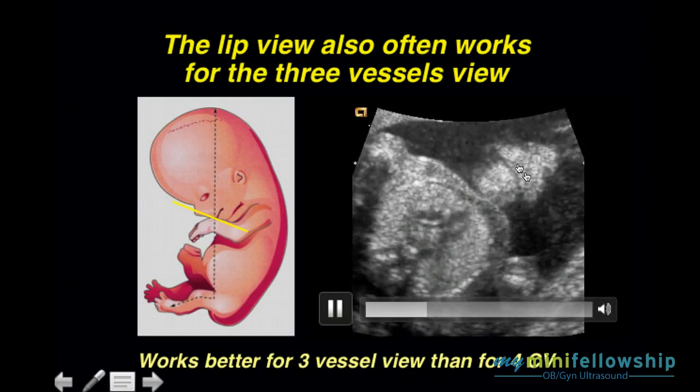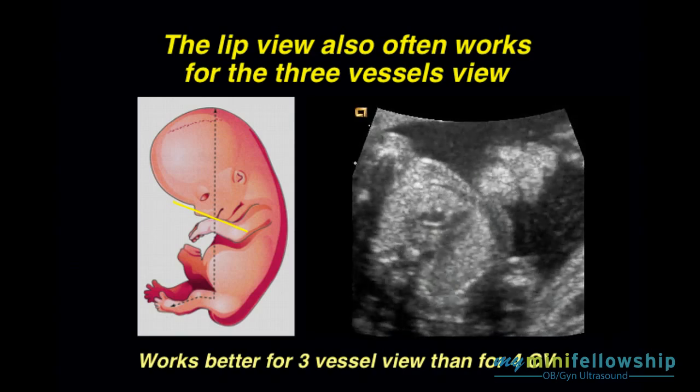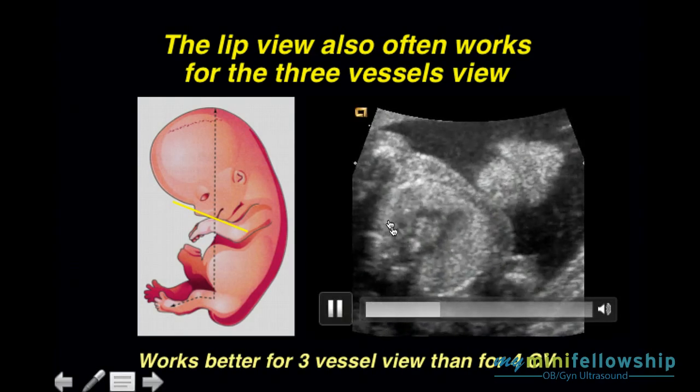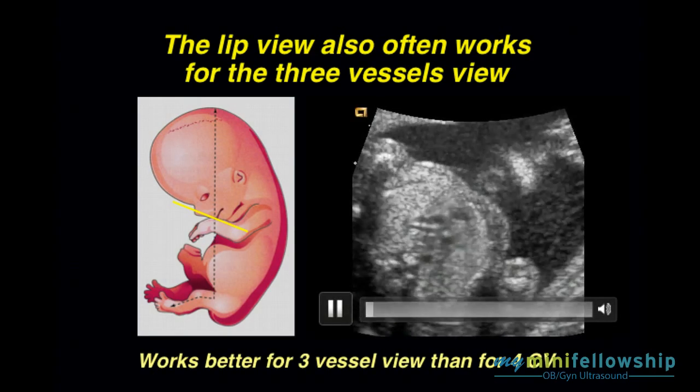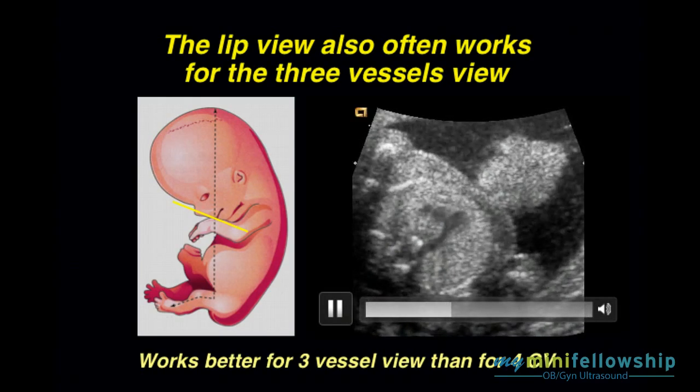So the sonographer here was getting me the lip. Wow, it's a beauty. I think you'll agree. But what else did I get? I got a perfect three-vessel view, and I want to be sure to take advantage of that.